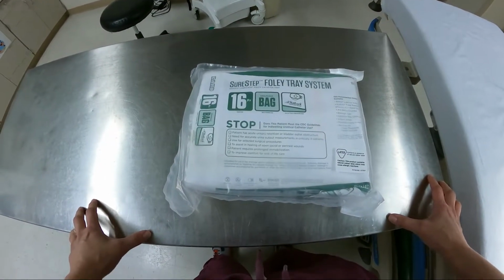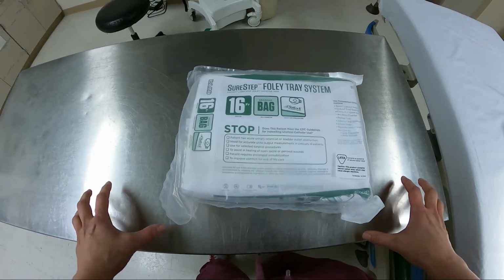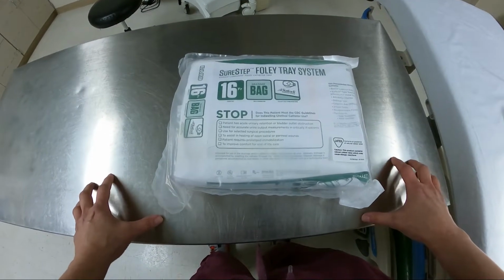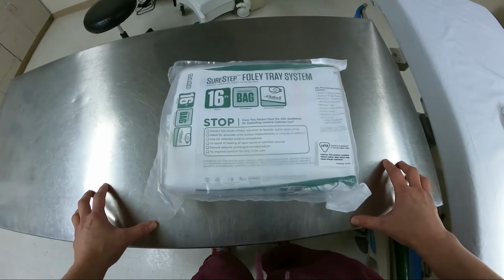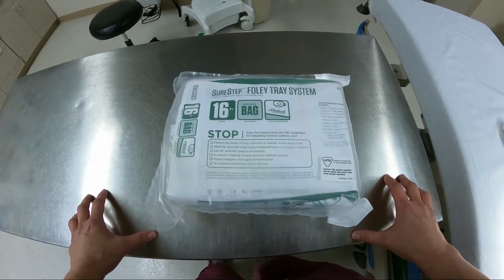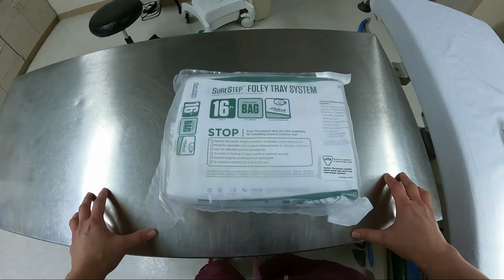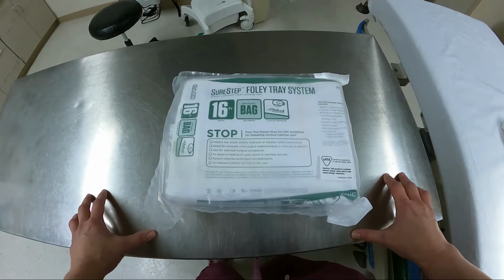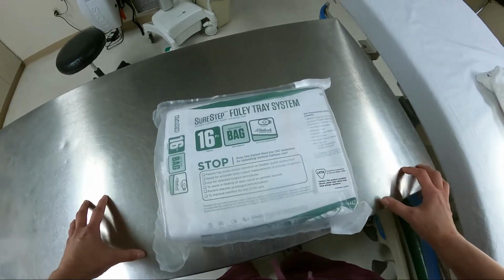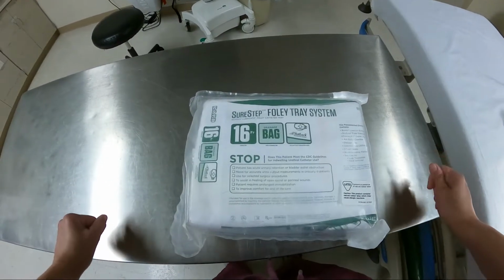Now, putting a catheter in correctly cannot be overstated, because incorrect insertion, incorrect cleaning, incorrect technique all lead to increased, sometimes exponentially increased, risks of urinary tract infections, which, especially in the elderly population, can lead directly to sepsis and then death.